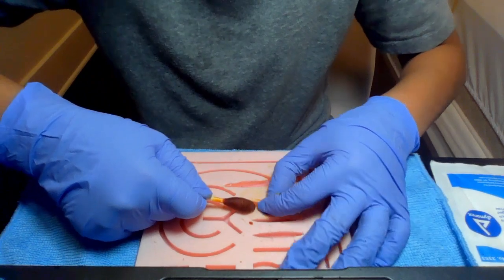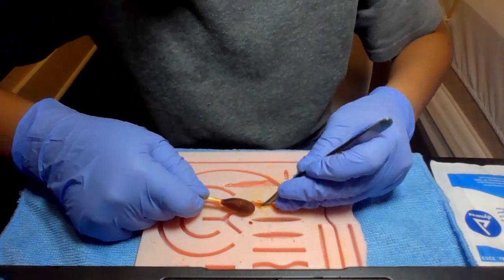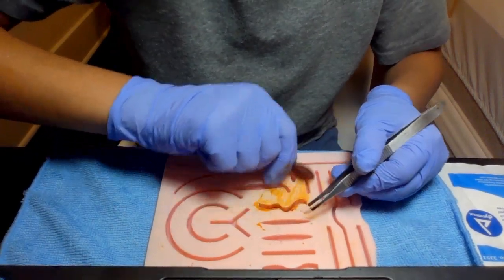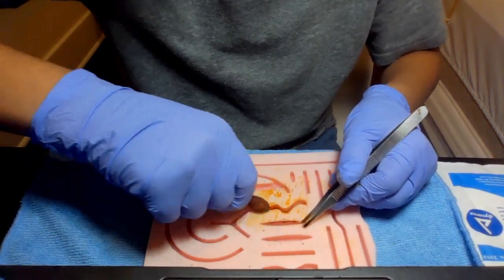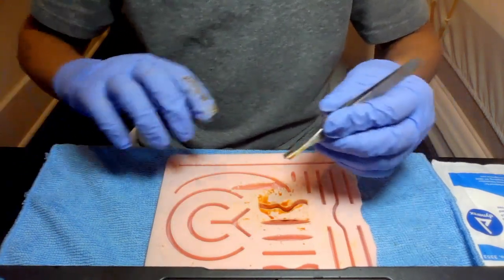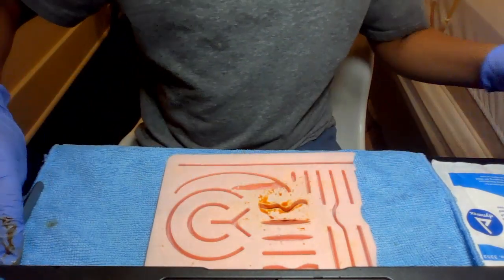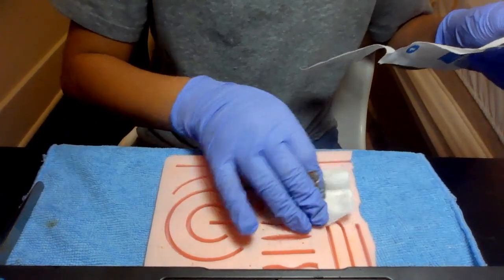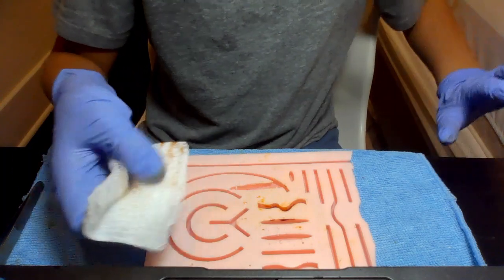So we're going to clean out all the spots, maybe take some forceps to open it up so we can clean it a little better, because we want to make this area very sterile and clean for when we're going to suture. Then we'll dispose of it. Next, we're going to let it dry a little bit. I'm just going to dab that up. So now we have our area in a sterile fashion.